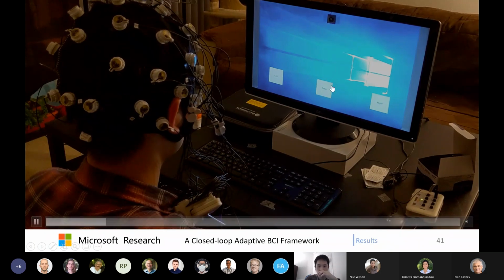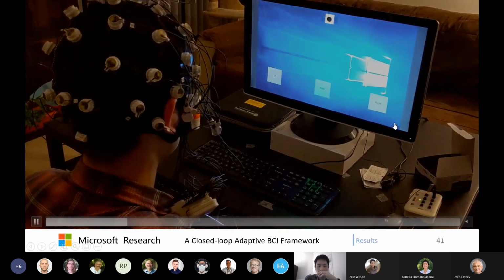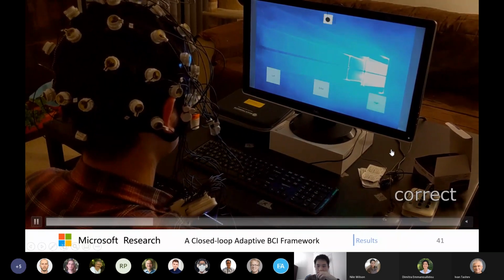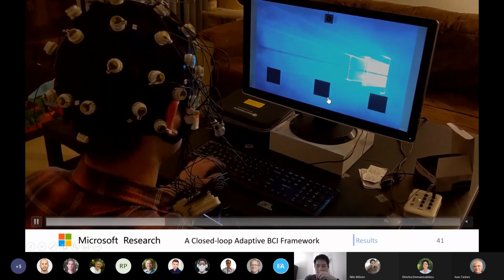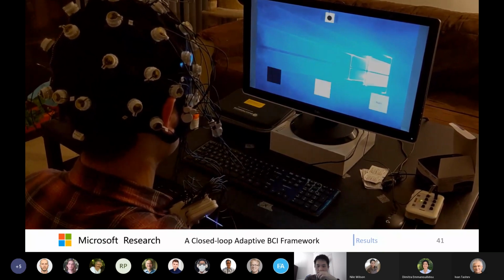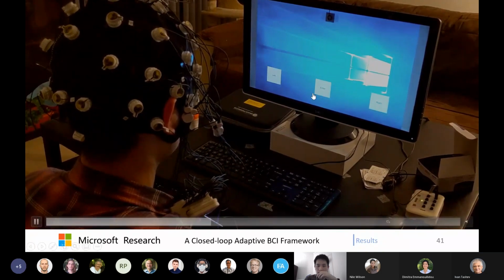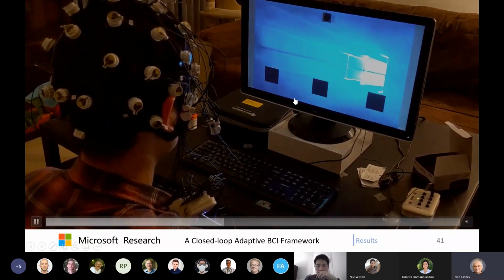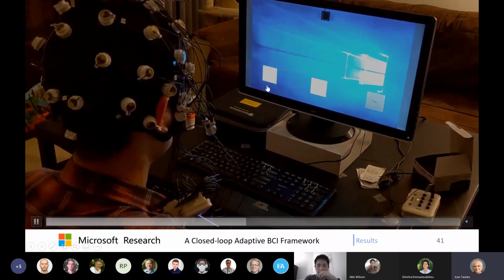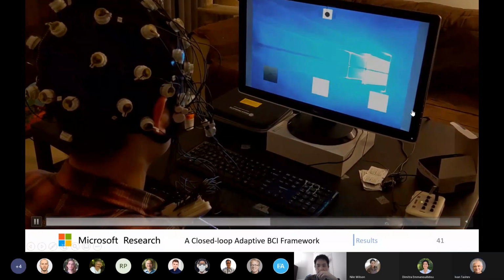And due to the color effect here, it's kind of hard to see the predicted result, but I think it's a bit laggy, but you can see that the result will be highlighted in green color. The predicted button is green. Yeah, the green one here.